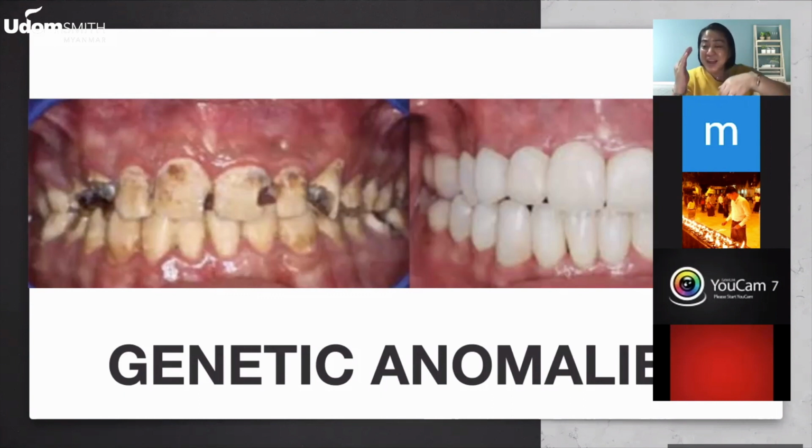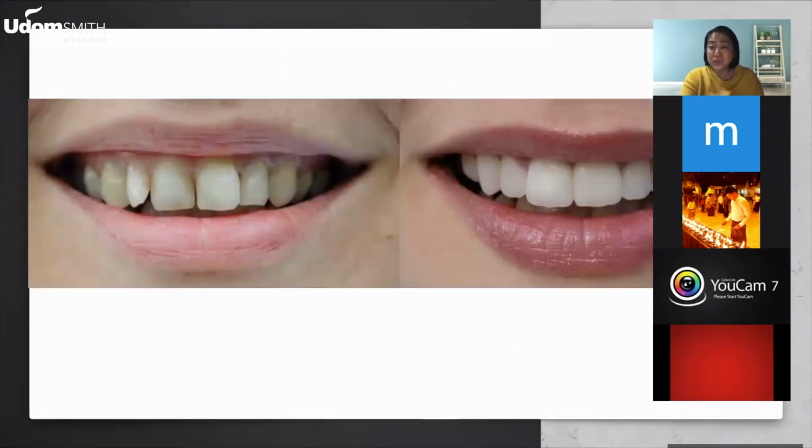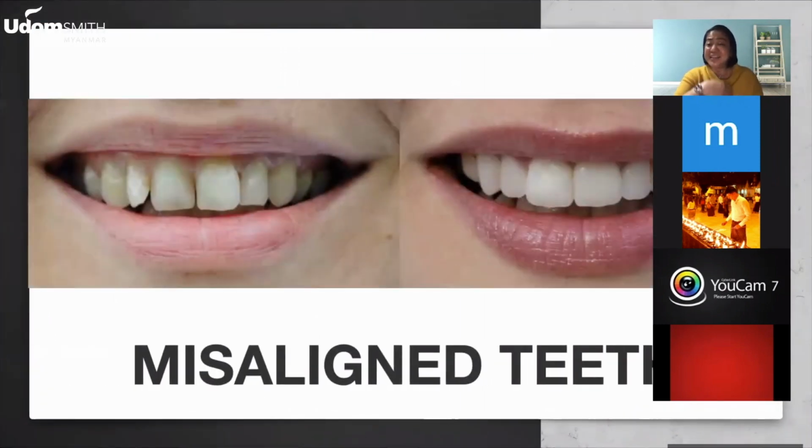Because Edelweiss gets its strength from the cement that you are going to use to install it on the natural tooth, on the composite itself, and on the tooth itself. So if you are going to use another composite and it gets debonded or breaks, then it is not the fault of Edelweiss anymore.